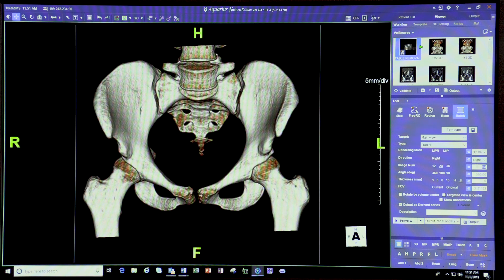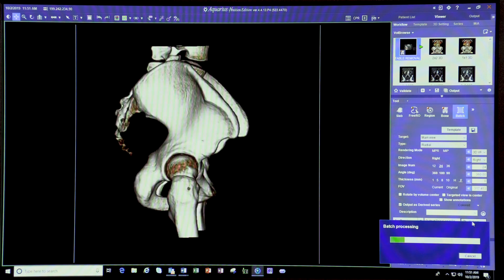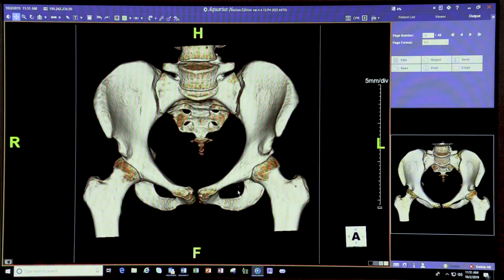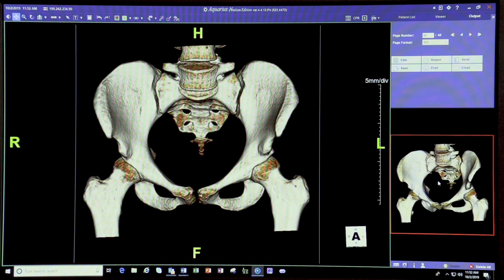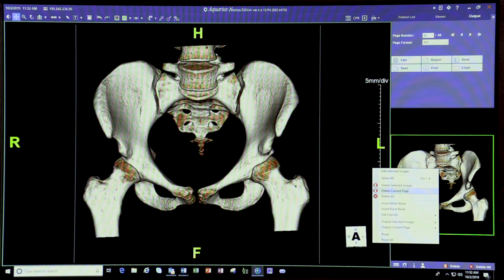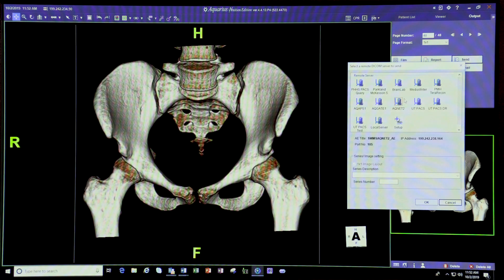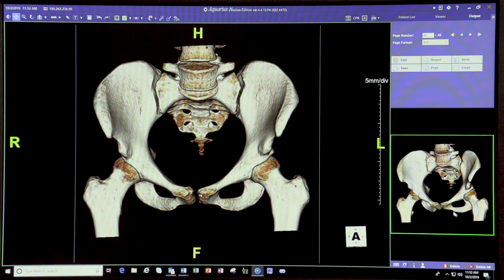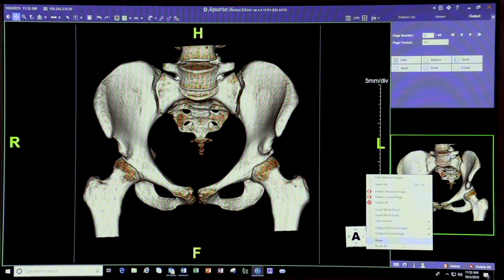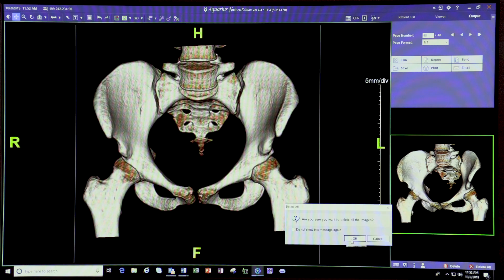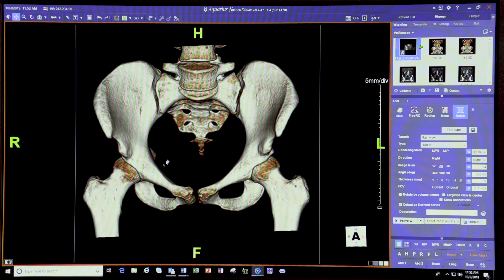The next step is to go right to left — or left to right, depending on your personal preference — and again we go to output. This shows the bones in side-to-side rotation as well. Then in the output panel, we do Control-A to select all images, delete them from the panel, and send these images to one of our back stations, either the University or the Parkland site. Once this is sent, we want to do individual hips and individual segmentations.